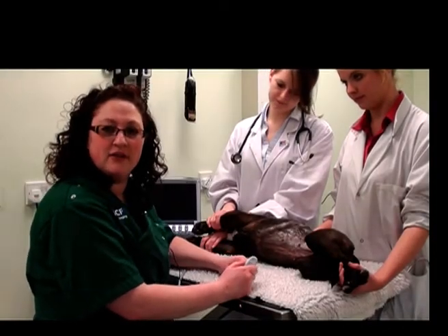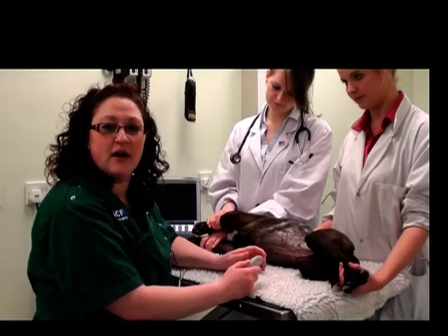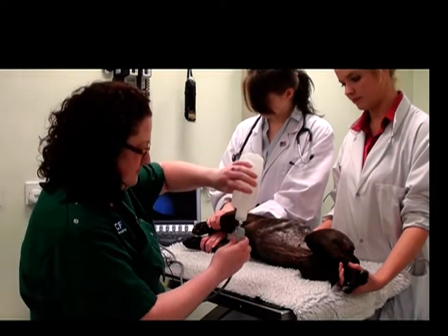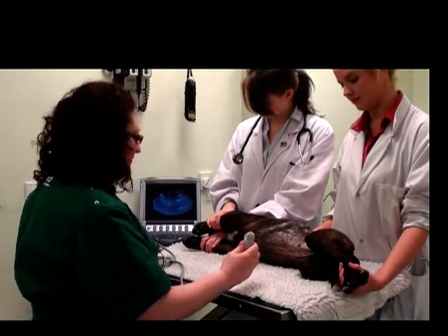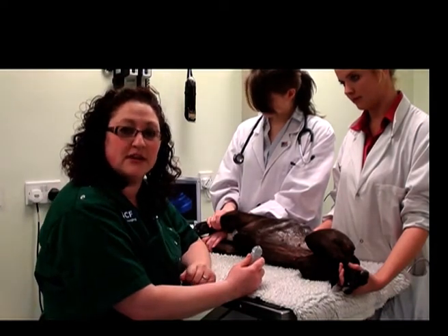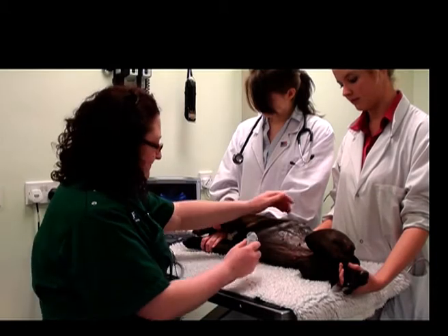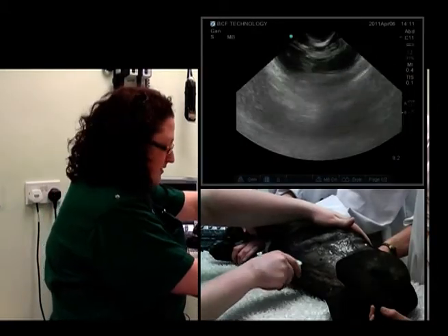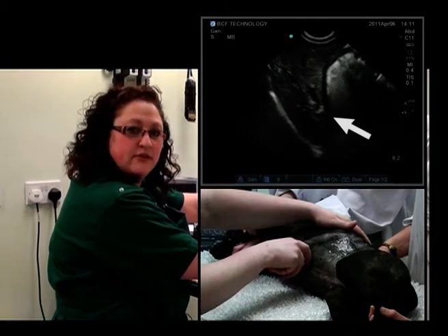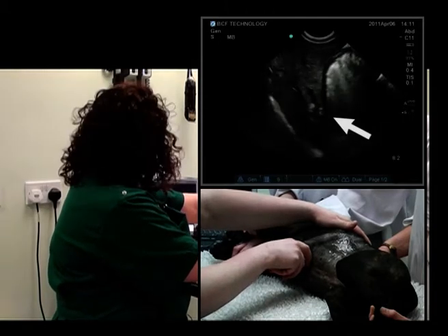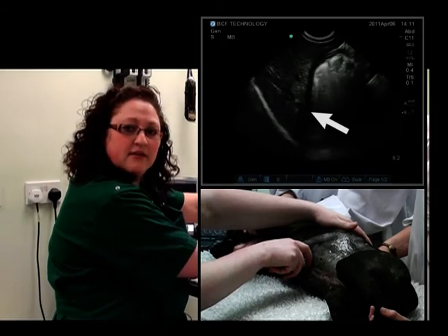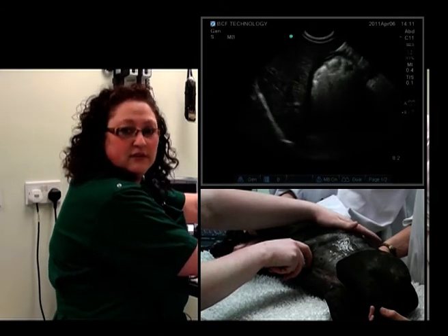Now we'll perform an examination of the GI tract, starting at the stomach. We've already seen the location of the stomach once before when we were looking at the liver, so we'll start there again. We'll go in the sagittal plane at the level of the xiphisternum, and the liver comes into view. We'll want to assess depth, gain, and time gain compensation for assessing the stomach.